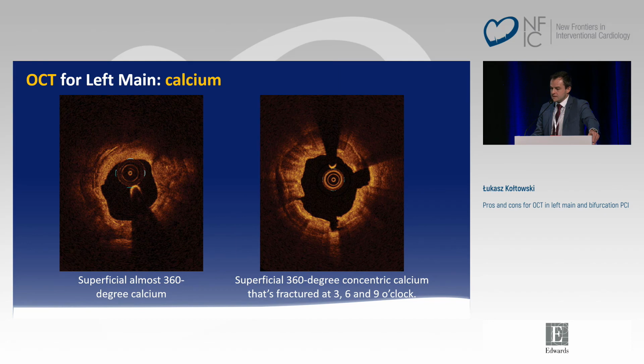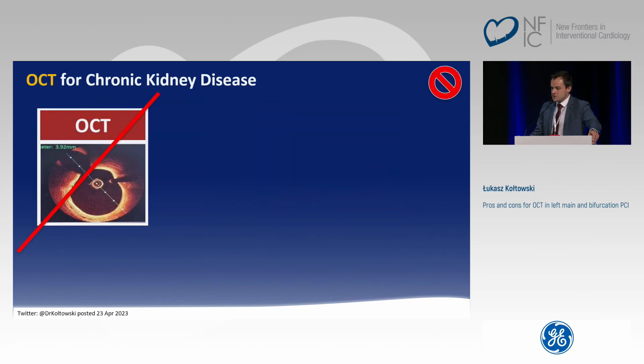The significance of calcium drives usage of debulking devices, and none of the debulking devices will be useful long term if it doesn't work in the short term. And OCT beautifully can show us whether we have done a good job or whether this job has to be repeated. And therefore, I think it explains why imaging helps us during the intervention, and not only for final check, but also during the staging.